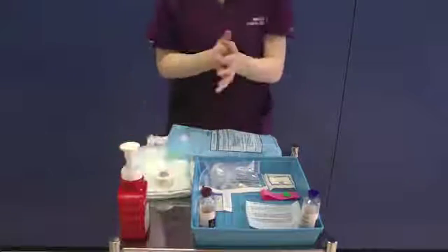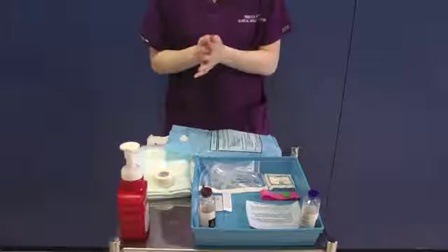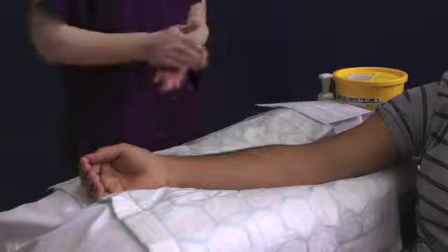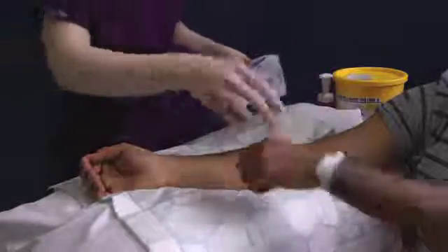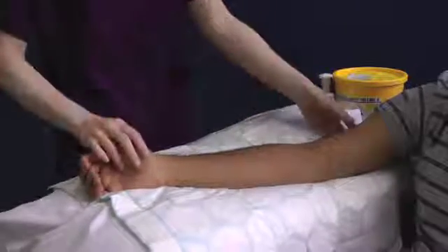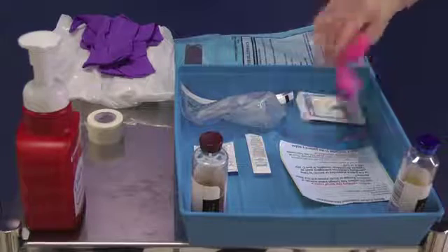Once you have done this, decontaminate your hands and proceed directly to your patient. At the patient's bedside, decontaminate your hands and reconfirm the patient's identity against the blood culture request form. Make sure that the patient is happy for you to proceed and position them so that they are comfortable, ensuring your equipment and Sharpspin are within easy reach.